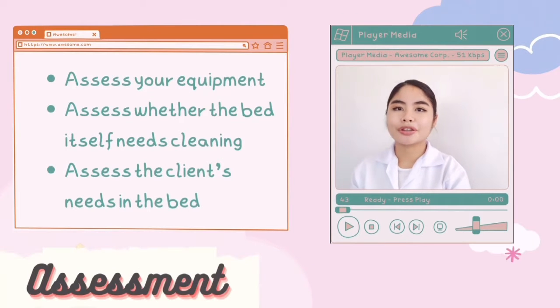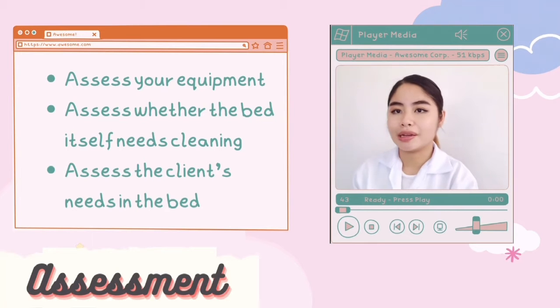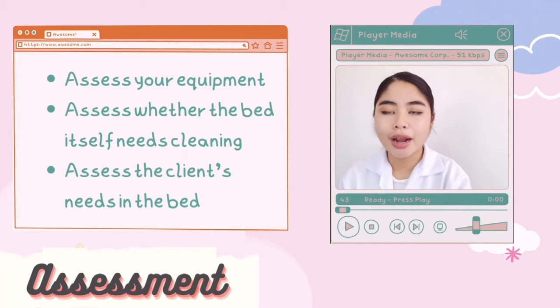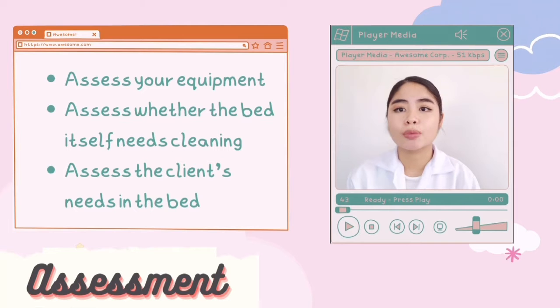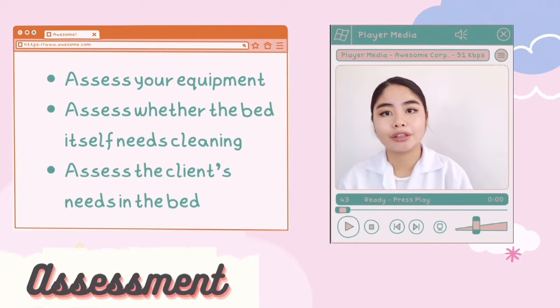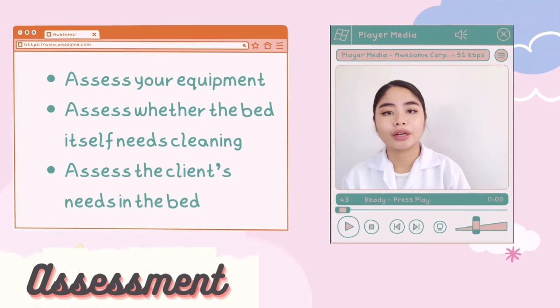For the assessment, you're going to have to assess your equipment. Check for all the linens necessary to change the bed. Check for the dirty linen hamper, and this facilitates a smooth procedure. Second, you're going to have to assess whether the bed itself needs cleaning prior to placing the clean sheets on it. This reduces transmission of microorganisms.